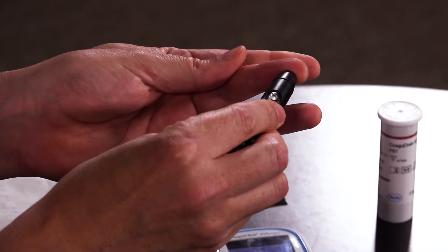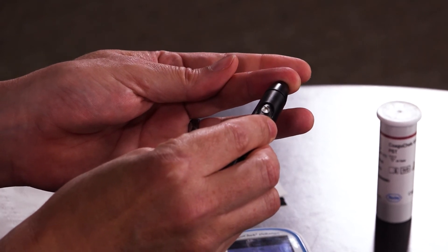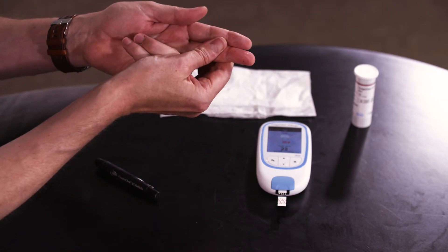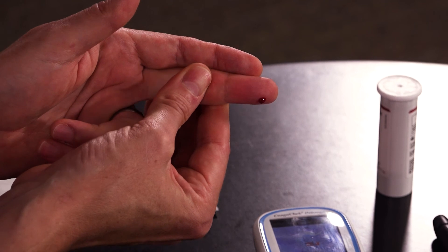Before lancing the finger ensure you thoroughly wash your hands using soap and warm water. Also make sure the finger is completely dry before lancing. To encourage the blood you can also warm the hand up, hang it down and milk and massage the finger. When ready press firmly against the side of the finger avoiding the tips, the pads and the knuckles, and to lance the finger press the button. Massage the finger to get 8 microlitres — remember that's a ladybird sized drop.